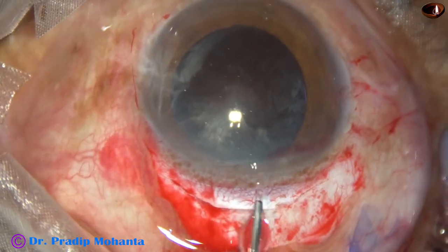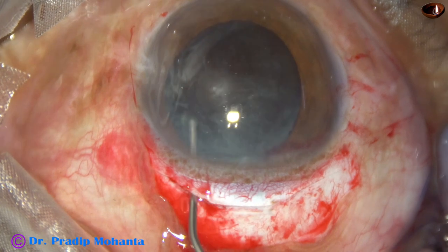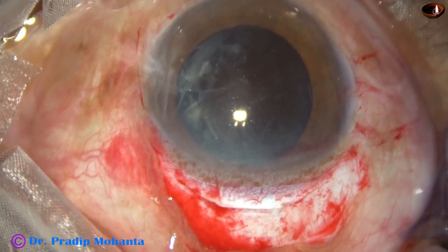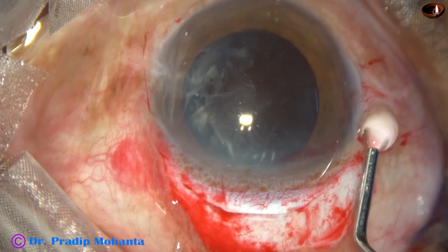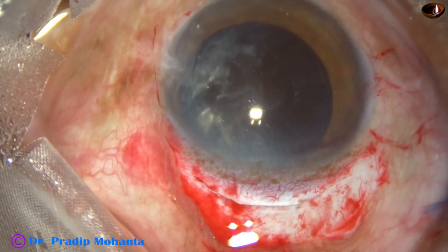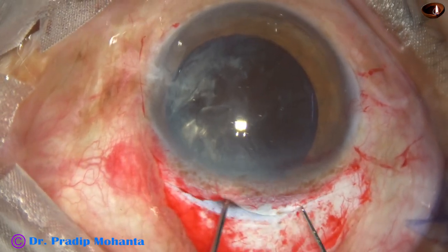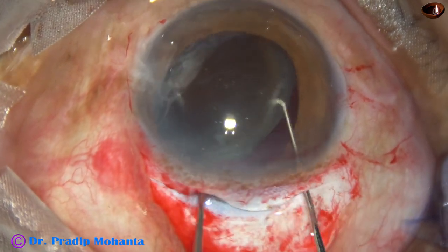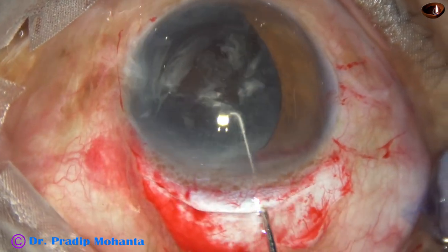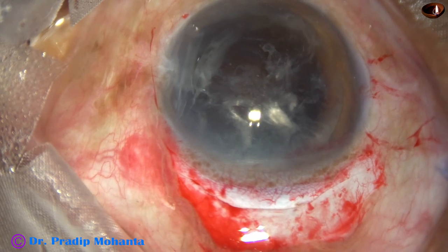What to do now? I do hydro for some more time, make the nucleus free. Yes, it is free. It is rotating nicely. And now I inject visco, fill up the anterior chamber with visco. This is 2% hydroxypropyl methyl cellulose. And now use two hooks and mobilize the nucleus and prolapse the nucleus out of this bag in this way. Just rotating the nucleus, and here it is. It comes out and occupies the whole anterior chamber.